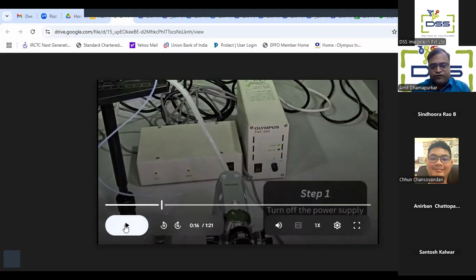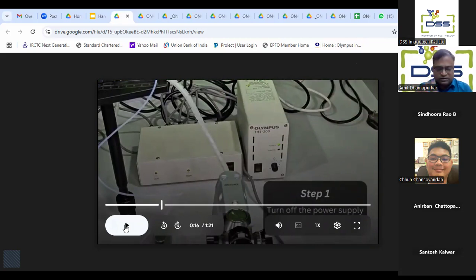So once the power failure occurs, we have to switch off the main control unit. If the control unit is on, you cannot do that. You can do it, but then the motor will get stuck. So to avoid this, we have to switch off the control unit at the very beginning to perform this task.